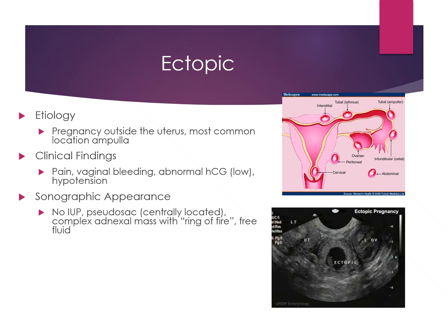Now, I mentioned paying attention to those certain structures on mom, right? Ovaries, uterus, and adnexa, because of all of the things that can go wrong. Ectopic being a big one. So ectopic pregnancy is any pregnancy that is not happening inside the uterus.